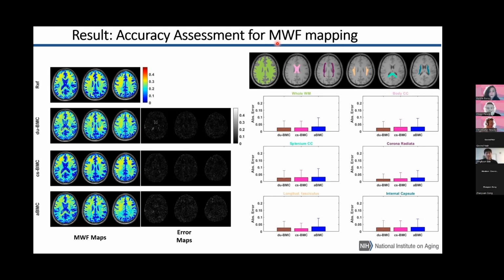Okay, thanks. And I've been doing a lot of B1 plus correction. Have you looked at including this into your models as well? Right. So that's a very good point. Obviously, B1 correction is needed. But again, that comes at the expense of increased scan time. So in this feasibility study, we didn't include it, but that's definitely in the pipeline along the way for future developments. Awesome. Thank you.